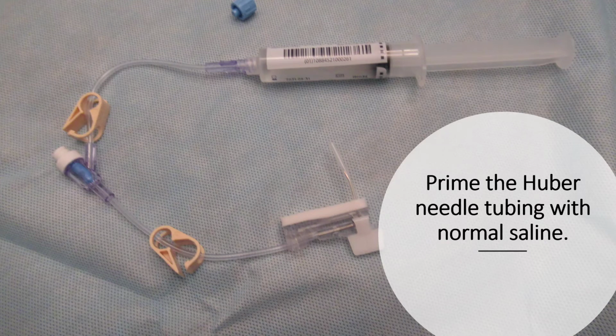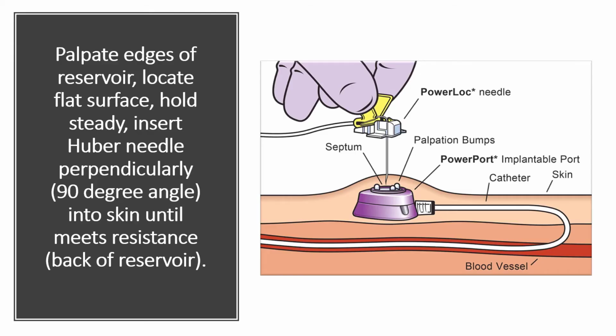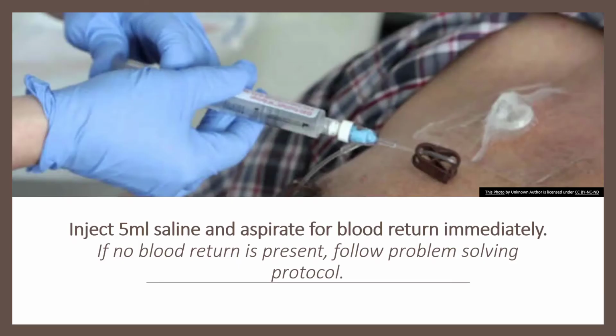We're going to prime the Huber needle and tubing with the normal saline that comes in the kit. We're going to palpate the edges of the reservoir, locate the flat surface, hold steady, insert the Huber needle perpendicularly at 90-degree angle into the skin until it meets resistance, which would be the back of the reservoir.